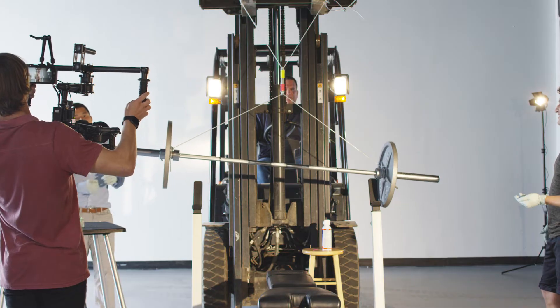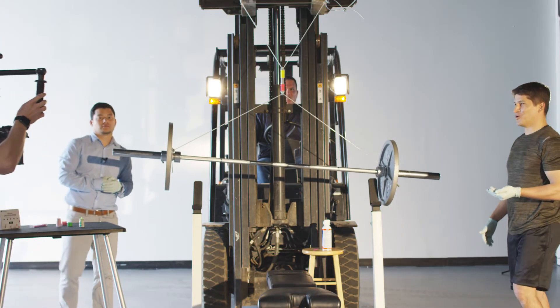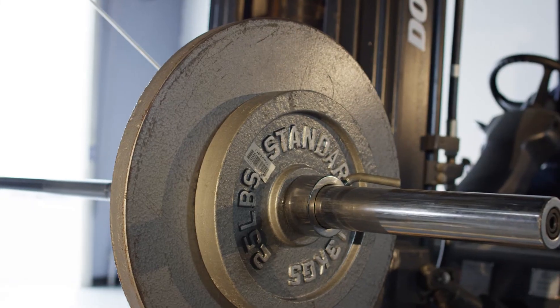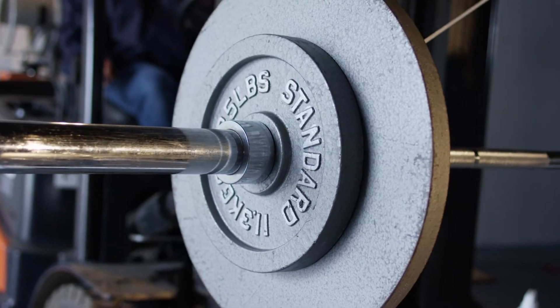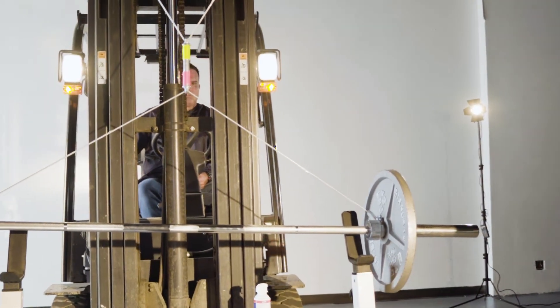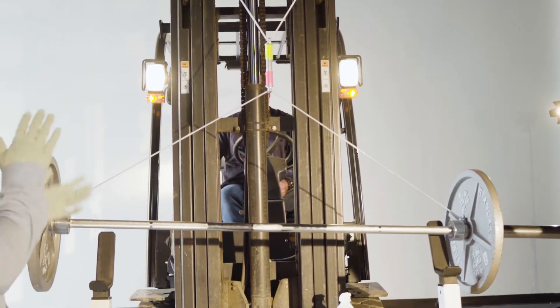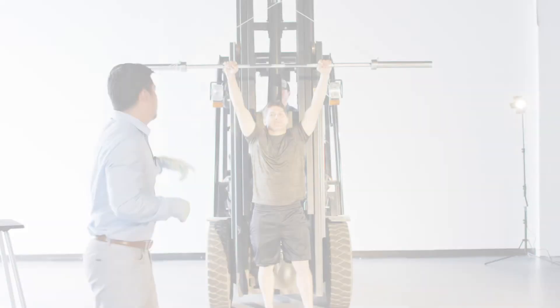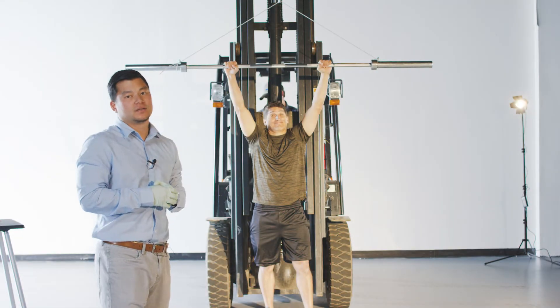There you have it — 135 pounds! We're going up to 185. Now with a little over 200 pounds, let's triple check this.